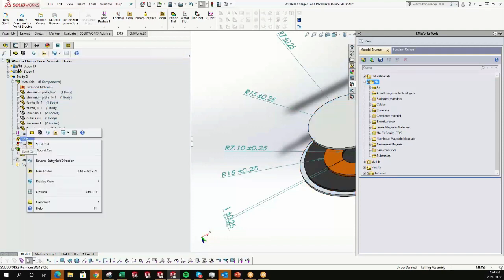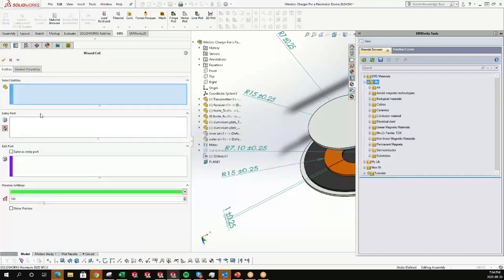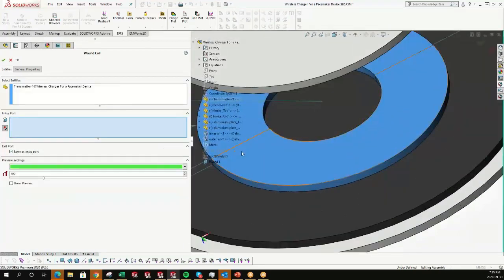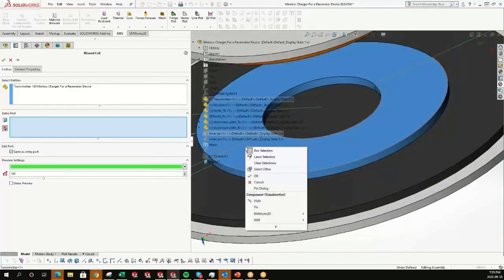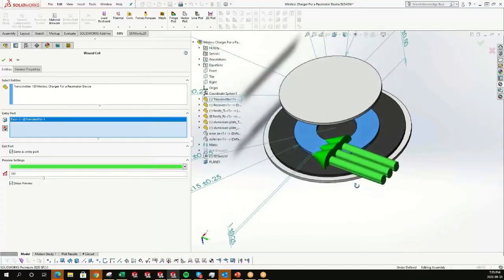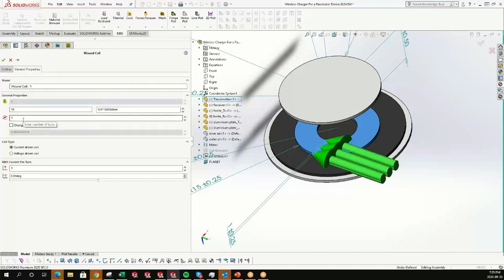So here is the option to define coils. We can define whether solid or wound coils by simply clicking. We choose this coil. We can define the entry port: select the face. It's the entry, and since it is a loop, since it is a coil, the exit will be the same. Here we have more options: the number of turns, the wire diameter, the conductor diameter, and the filling factor, which can estimate the amount of copper inside this coil. We can define whether it is a current-driven coil or a voltage-driven coil.